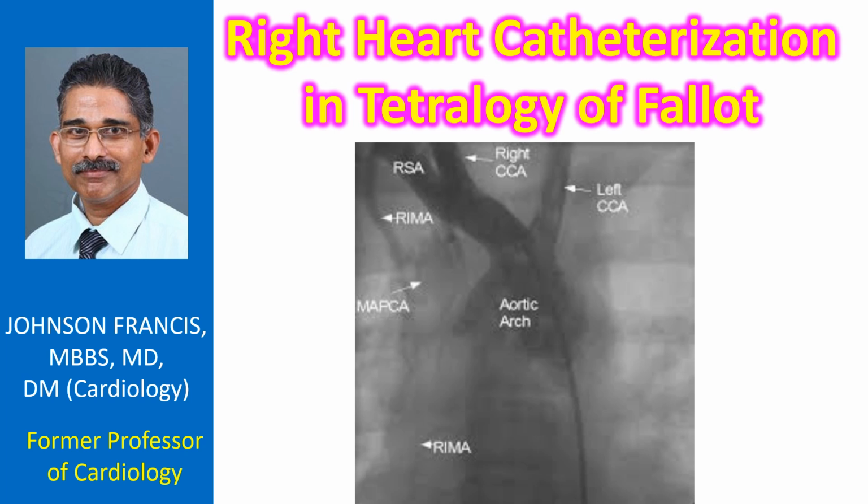Another important role is for detection of coronary anomalies, which can also be seen on echocardiogram sometimes. Magnetic resonance imaging is another way of documenting coronary anomalies.